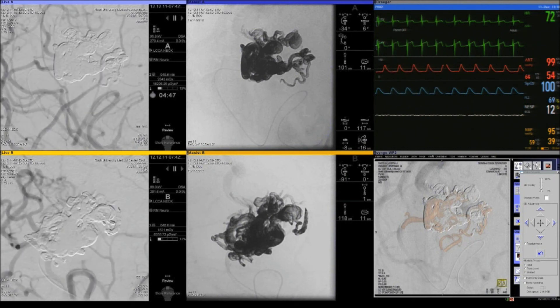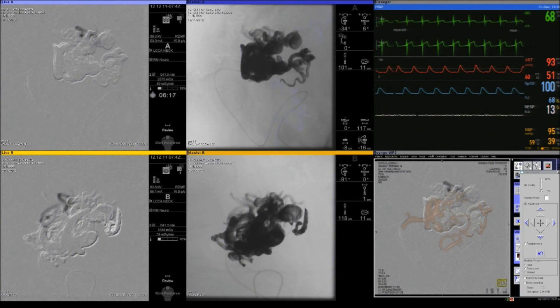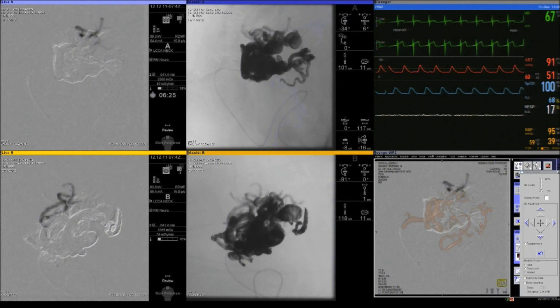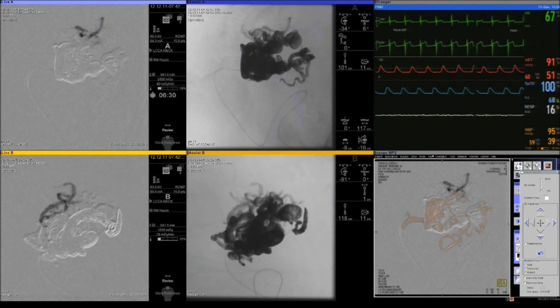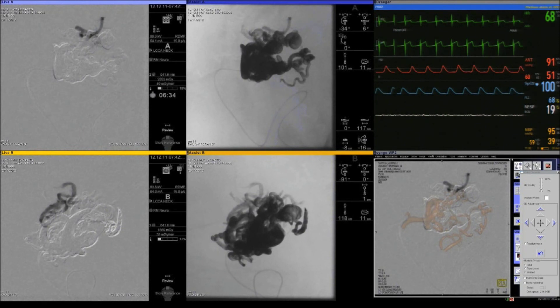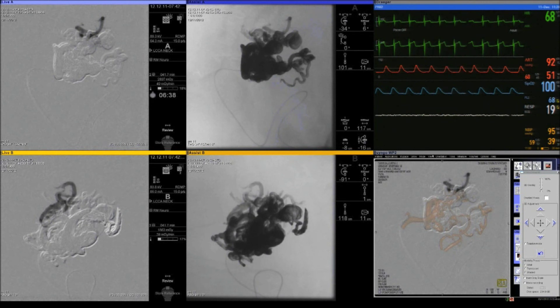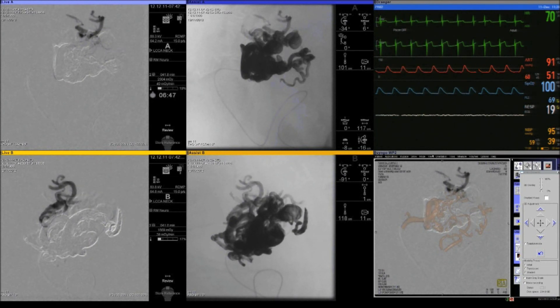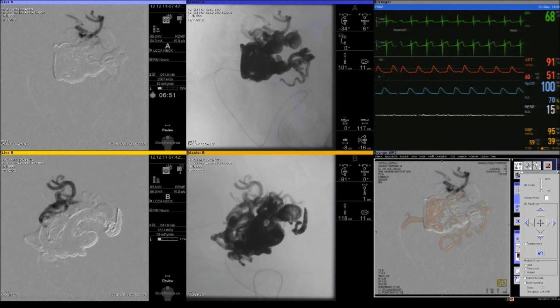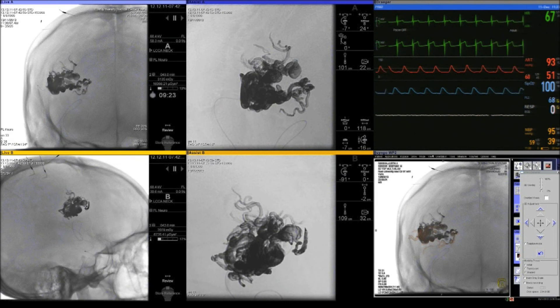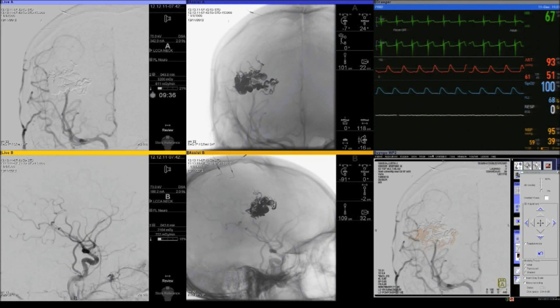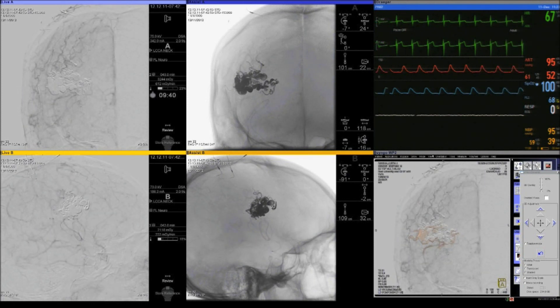At this point, I feel we have to continue embolization until we completely occlude this AVM, since there is significant slowdown on the venous side. It is very hard to stop and stage at this point, as I would be concerned we have compromised the venous drainage. Part of the concept of embolic cure is having patience, but being conscientious that once you start this process, you may not be able to stop without achieving complete angiographic occlusion — as we see in the final views now. If I felt I could not embolize further, this patient likely would have to go to open surgery immediately after to avoid hemorrhagic complications.